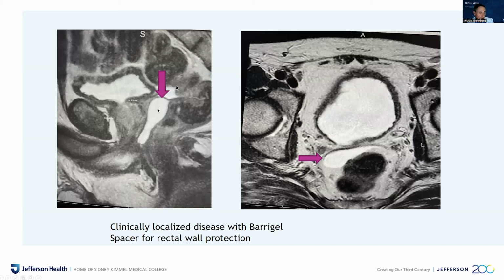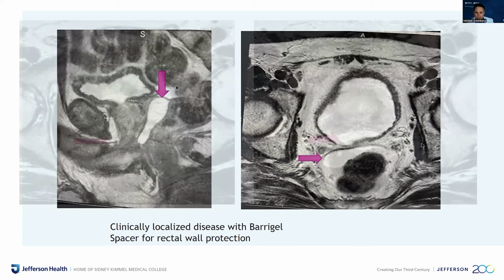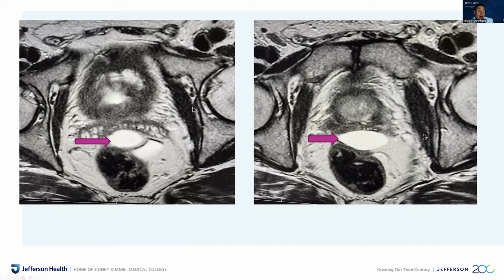So here you can see I was able to place it under this prostate, from the apex at the bottom of the prostate all the way up well above the seminal vesicles, totally displacing the rectum. And here from top to bottom, because these are really the cuts that show you how symmetrical it is, you see this white disc-like area. So that's the hyaluronic acid. It's a gel, it's soft. It moves with the rectum, so you will not feel it with bowel movements. You really will not know it's there. And we're able to shape it depending on where we need it.